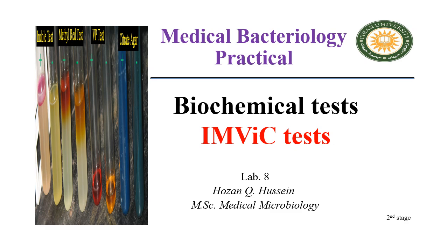Good day, dear student. Today we will discuss another important group of biochemical tests used in medical bacteriology, which is called the IMViC test. As a medical lab student, we should understand that biochemical tests are essential for identification of bacteria according to the metabolic activity. Now, we will explain what we mean by the IMViC test.